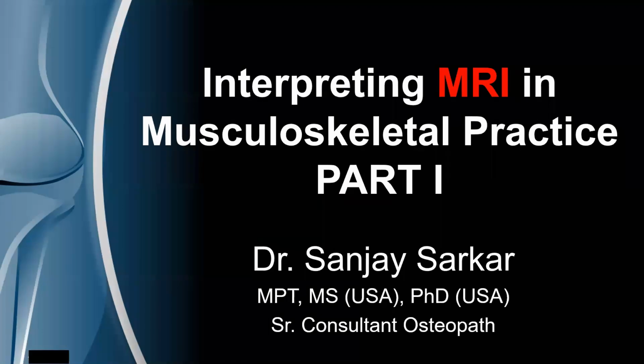If either a surgeon or a physician or an allied healthcare professional wants to know more in terms of what pathology is going on beyond bone, to differentiate between bone and soft tissues, or soft tissues and nerves, or neural structures and intervertebral disc, or what is going on between ligaments, tendons, and cartilage, then only you are going to ask or order for an MRI. Otherwise, you don't need an MRI at all, right? So please bear that in mind. You just don't want an MRI for the purpose of just having an MRI in your hand. Makes sense? Right.